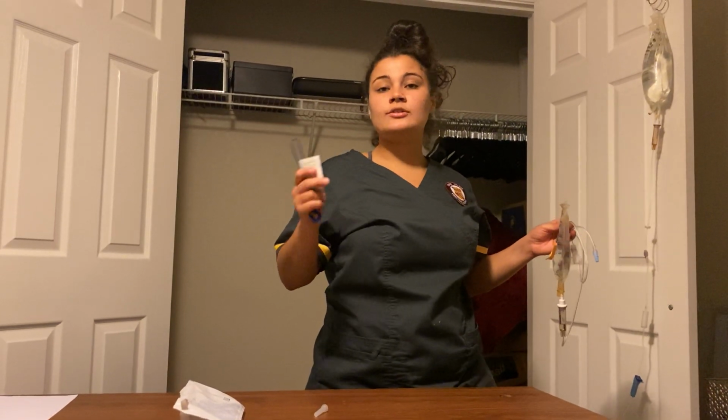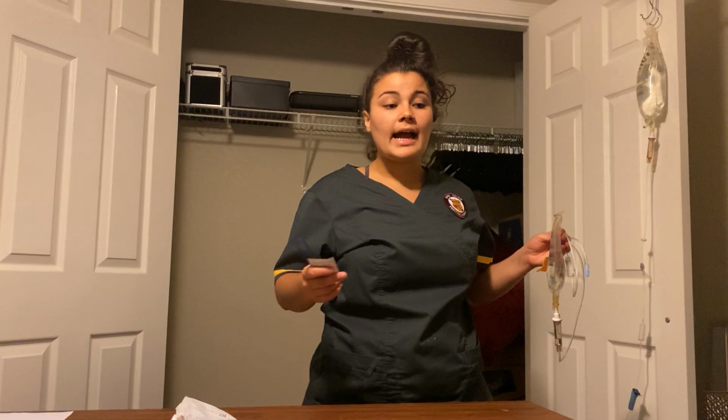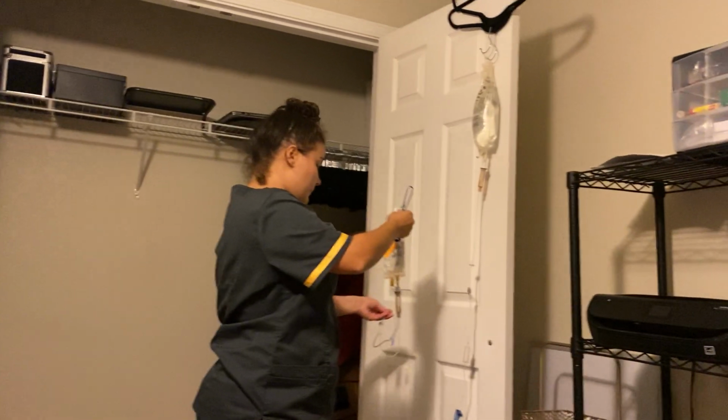After I do that, I'm going to perform hand hygiene. After I perform hand hygiene, I'm then going to hang my medication back up.